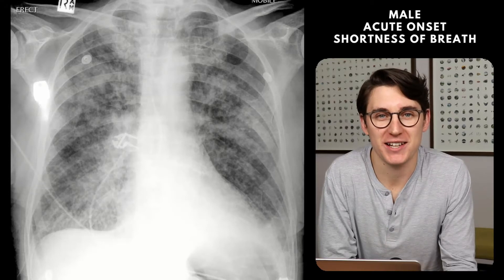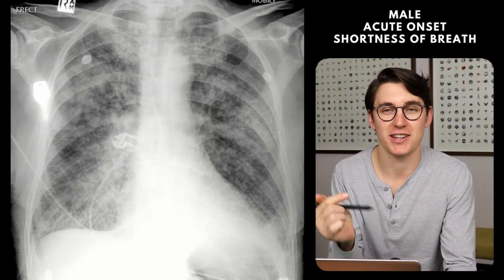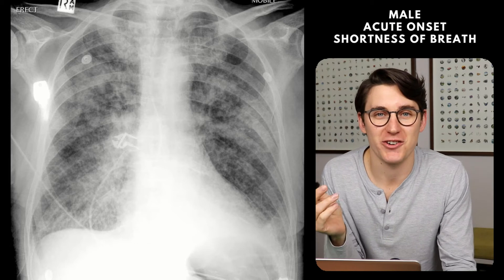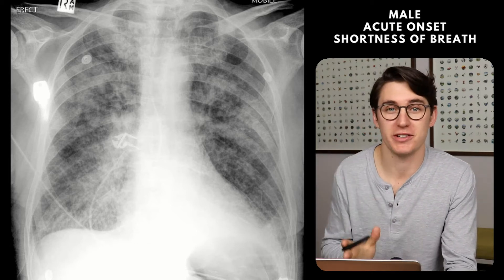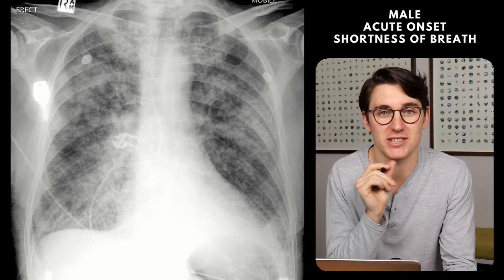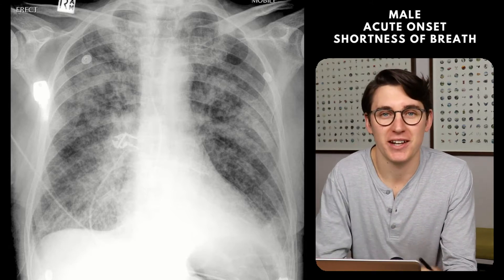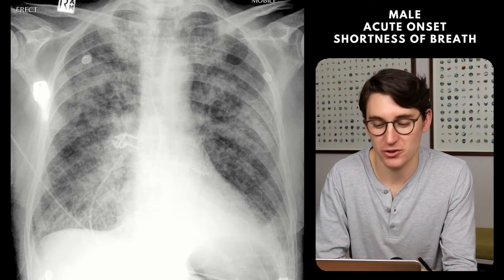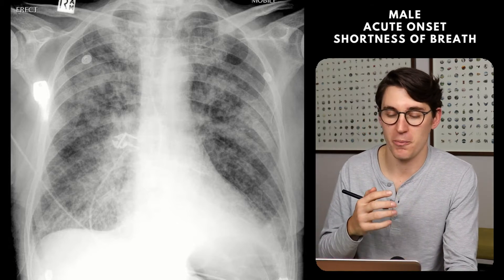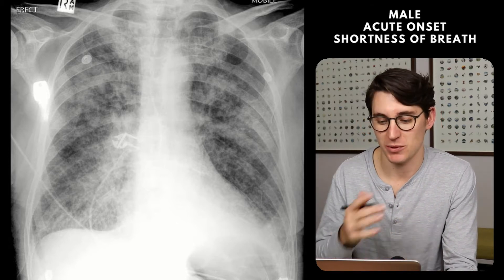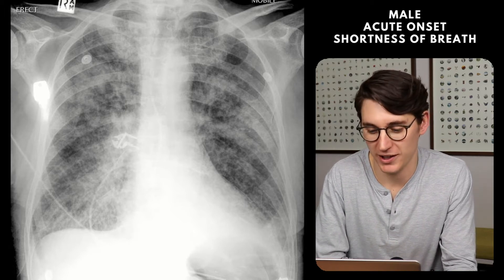Hello everybody, welcome to the second practice viva examination case. We're going to be having a look at this chest radiograph today. I encourage you to pause the video and make your own concise summary, confidently state the positive and negative findings that you feel are relevant to this case, and then I'm going to share my summary as well as a list of differentials so we can compare ours to one another.